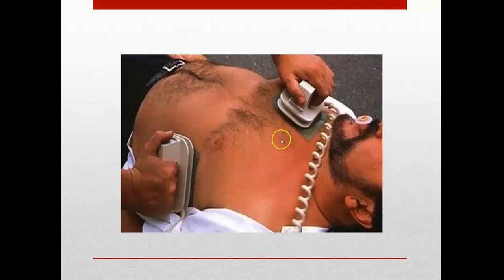But if you have time and you can grab the clippers and shave a big enough area off, it just helps get better contact with the skin. It's going to prevent burns. It's going to make sure that full impulse is getting to the skin and it's not just hanging out in limbo. But like I said, a lot of times you don't. You just have to pick a spot that's not as hairy.